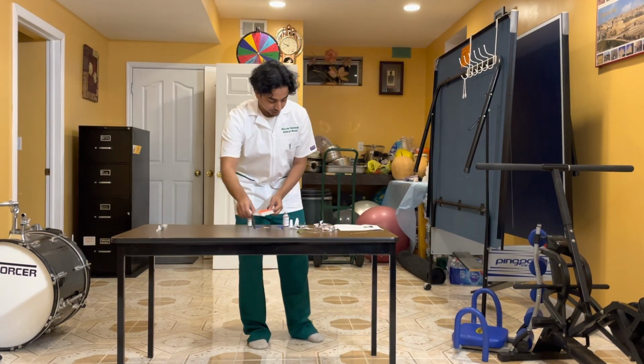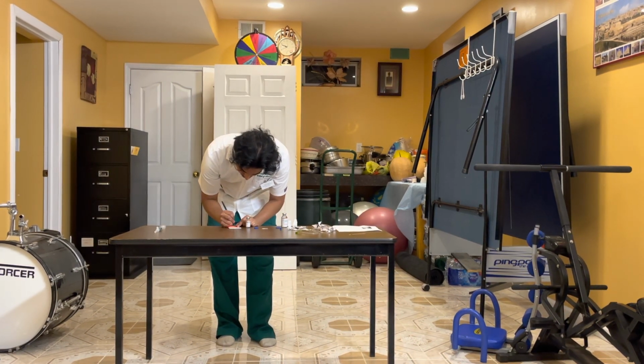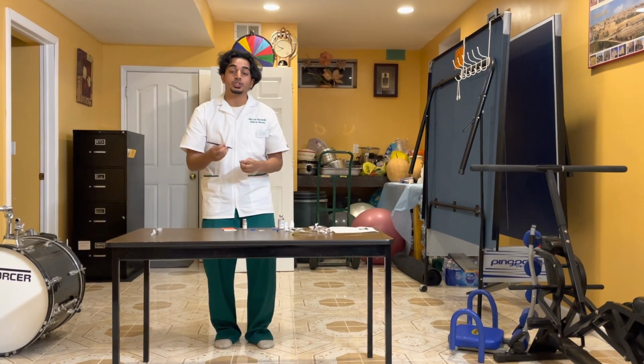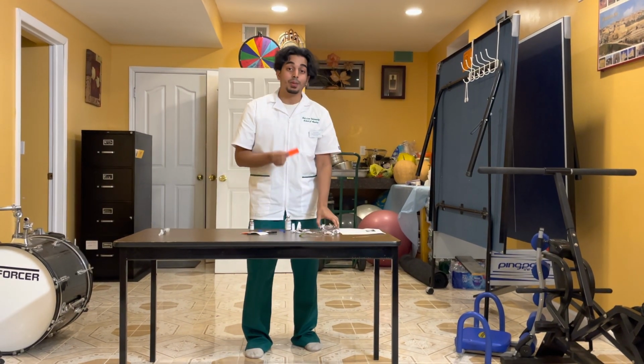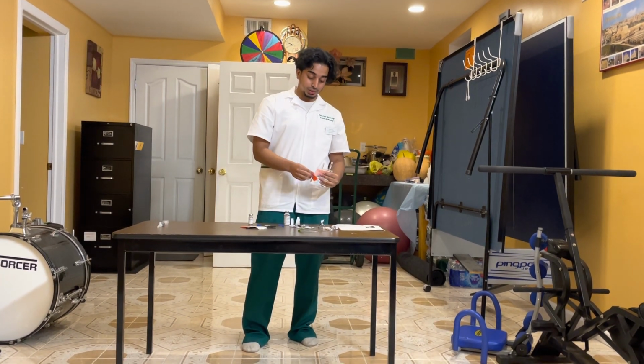I'm going to be writing down the medication. I'll be writing down the patient, the drug, the time, and the dose so that the next nurse can know what's going on. I'm going to be taking out the sticker and I'm going to be putting it on the back of the IV bag to make sure that you're still able to read the front.